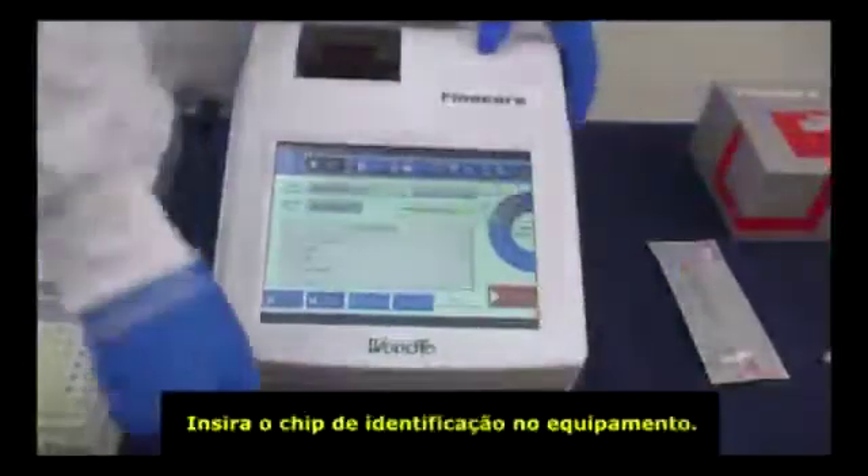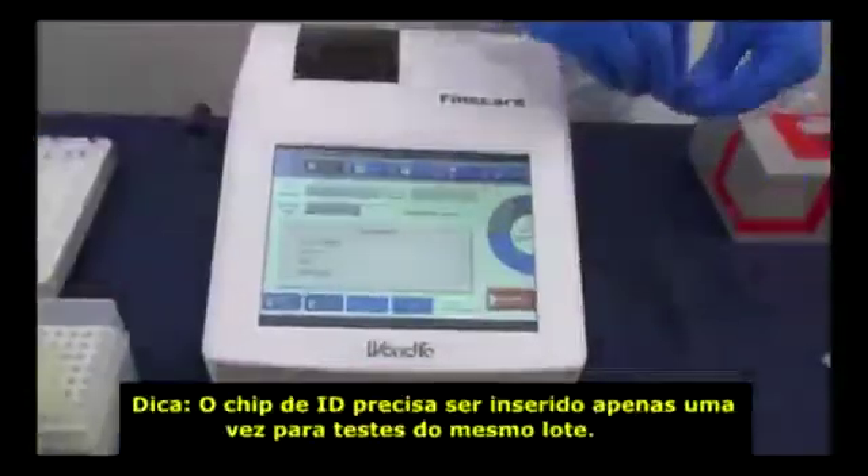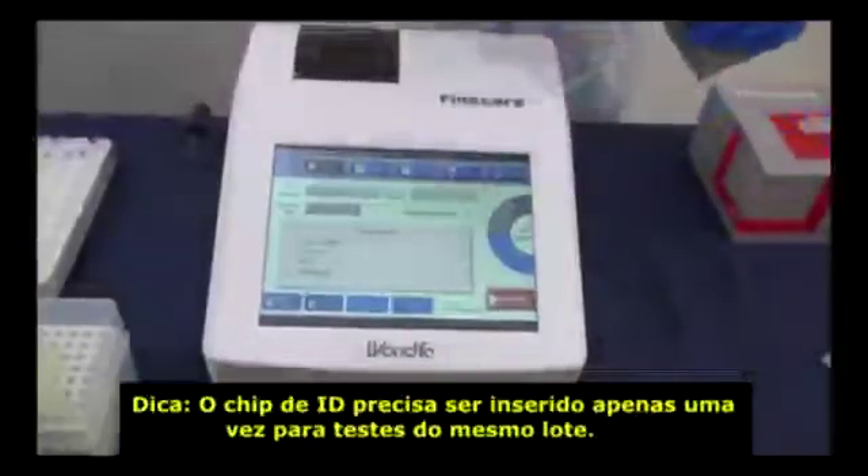Then, insert the ID chip. Note that the ID chip only needs to be inserted once for tests of the same lot number.